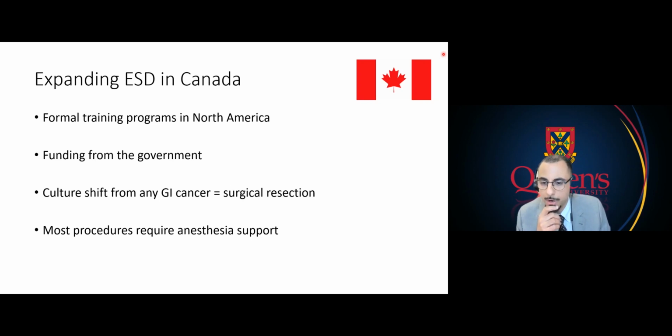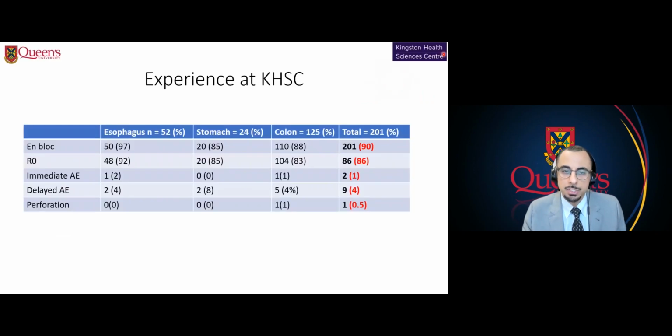And most procedures require anesthesia support. And that, again, can be a challenge for many academic centers, to get anesthesia support for endoscopic procedures. And just to briefly go over our experience, we've done about 200 cases.